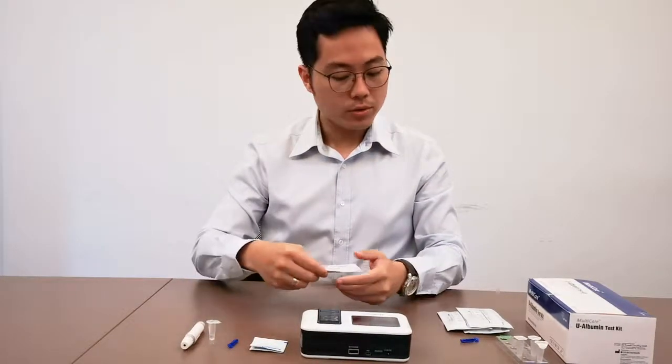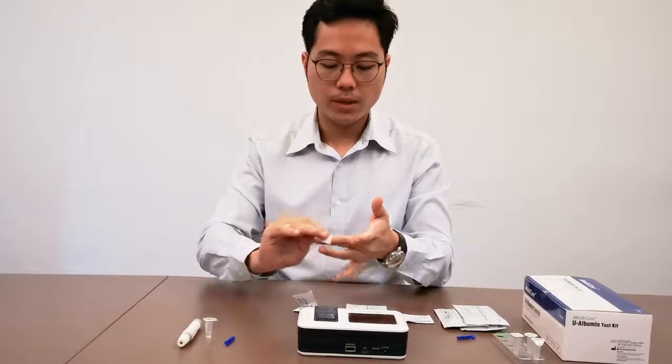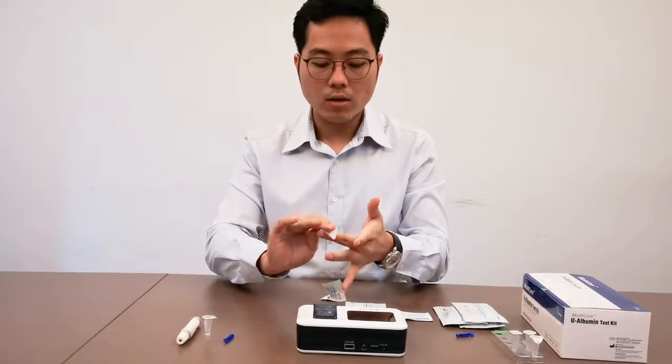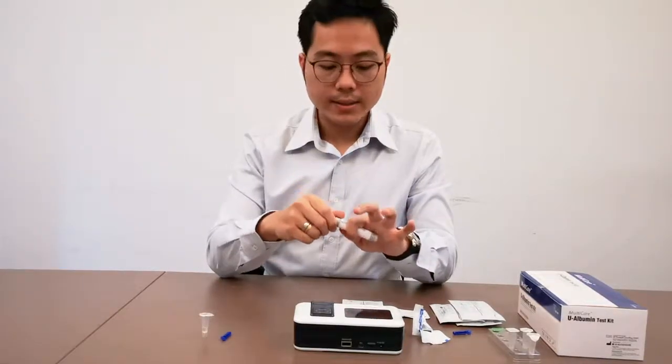So what you do now is that we prepare the patient's finger for pricking. We wipe it thoroughly and let the alcohol dry. Meanwhile, while we are waiting for it to dry, we prepare our lancing device.